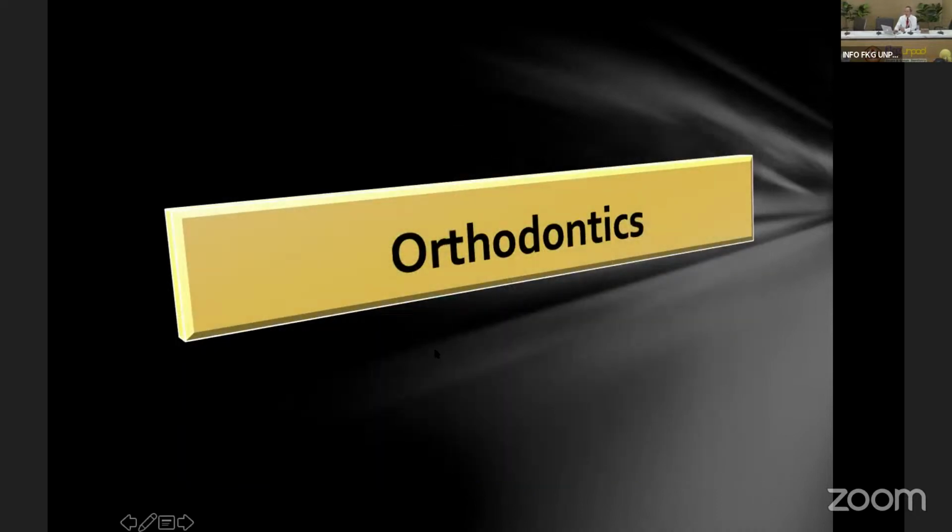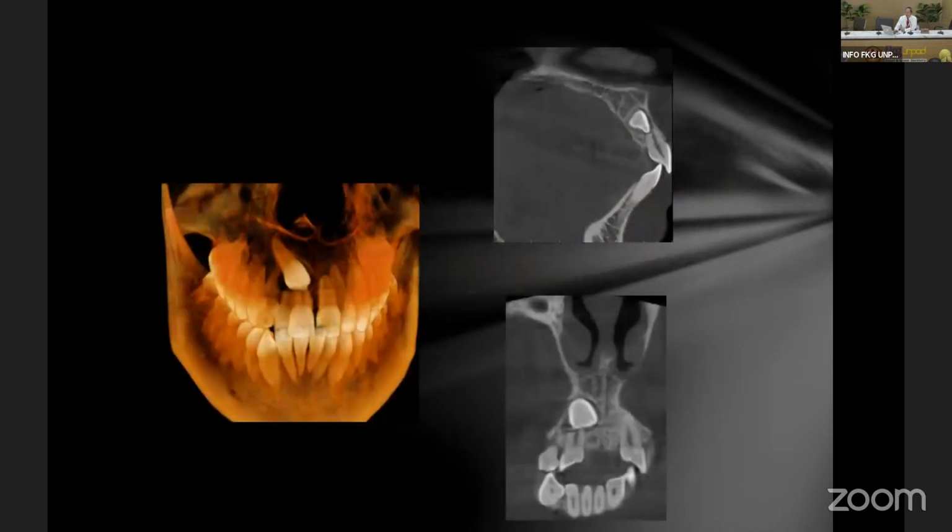Now, for orthodontic treatment planning, the cone beam is also helpful. A lot of the time we do that. With an impacted canine, you need to know if it's affecting the adjacent lateral incisor or first premolar. Like this one, it has significant resorption of the adjacent tooth.